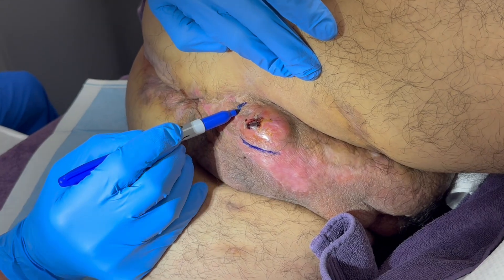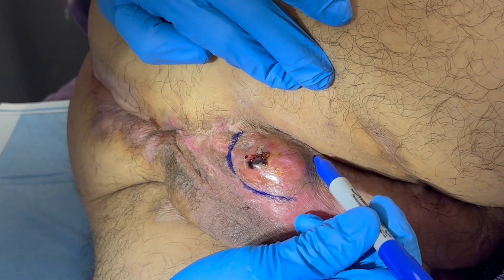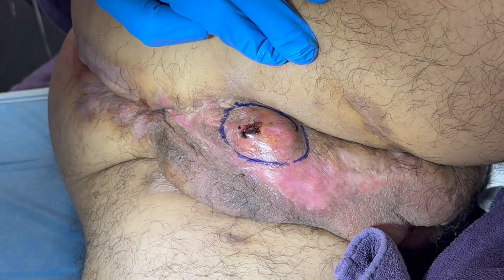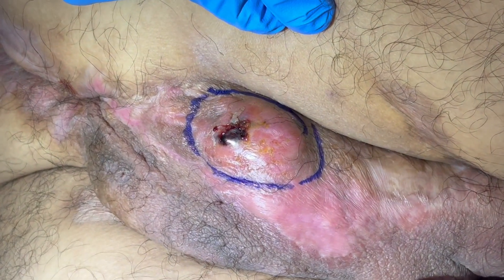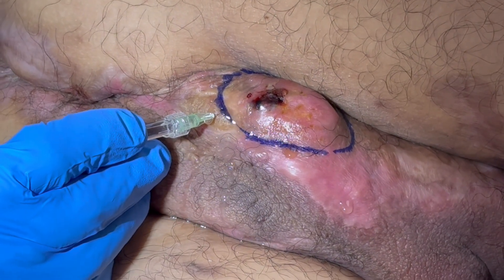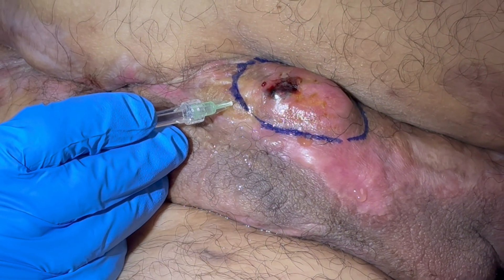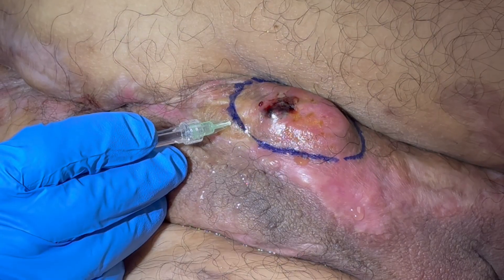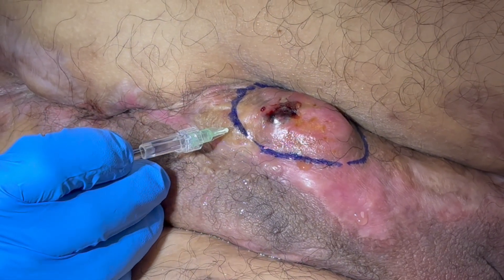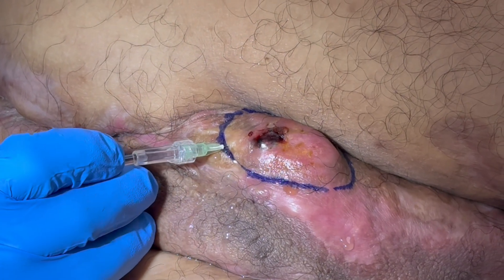I'll show you the excision of this using tumescent epinephrine, lidocaine, and ertapenem. This is an acute onset, severely painful, deeply penetrating HS abscess involving the scrotum and inguinal area, present for less than five days. Obviously the scrotum is a very sensitive area. This is a 32-gauge needle, four millimeters long, to gently infiltrate this lesion and deliver the local anesthesia painlessly. It's a very sensitive area, so it requires a slow, deliberate, careful infiltration. He feels no significant pain and we're getting great hemostasis.